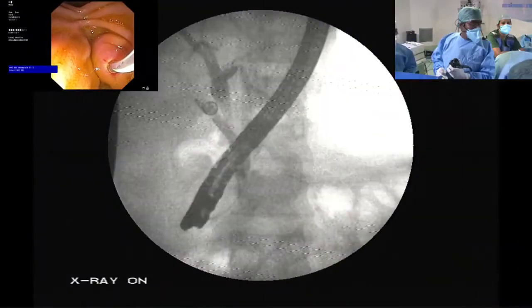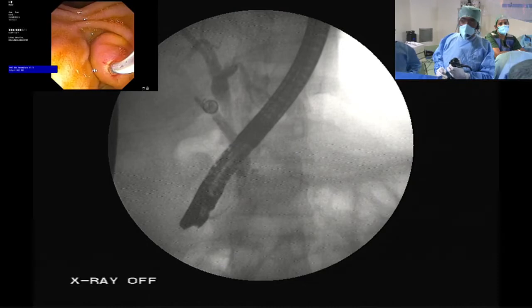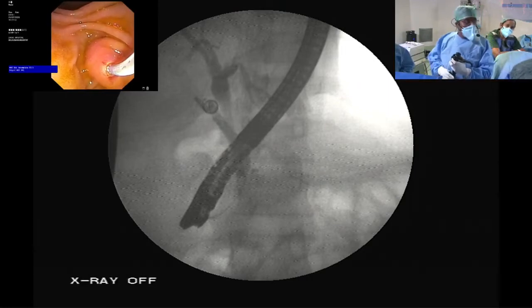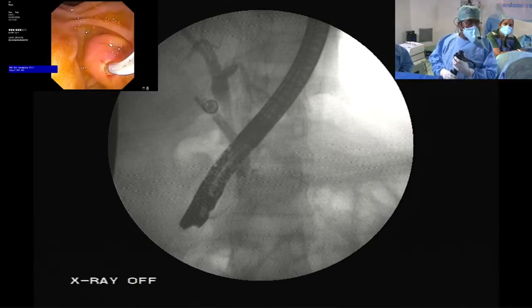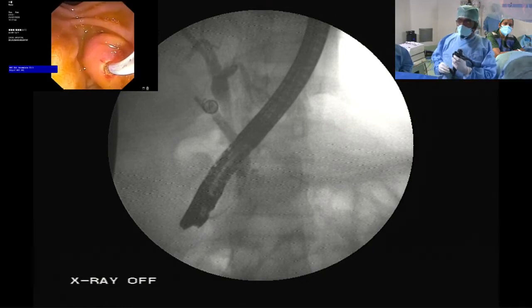It's actually a low-lying cystic duct. You can see it separately. There is a slightly dilated system. The common hepatic duct diameter is more or less the size of my scope. The scope size is around 10.2, so it is around 9, definitely more than 9 mm. So there's definitely a dilated CBD. You have to take the size of your scope in order to measure, because of the magnification. Even the cystic duct caliber is quite large. So there is no doubt.